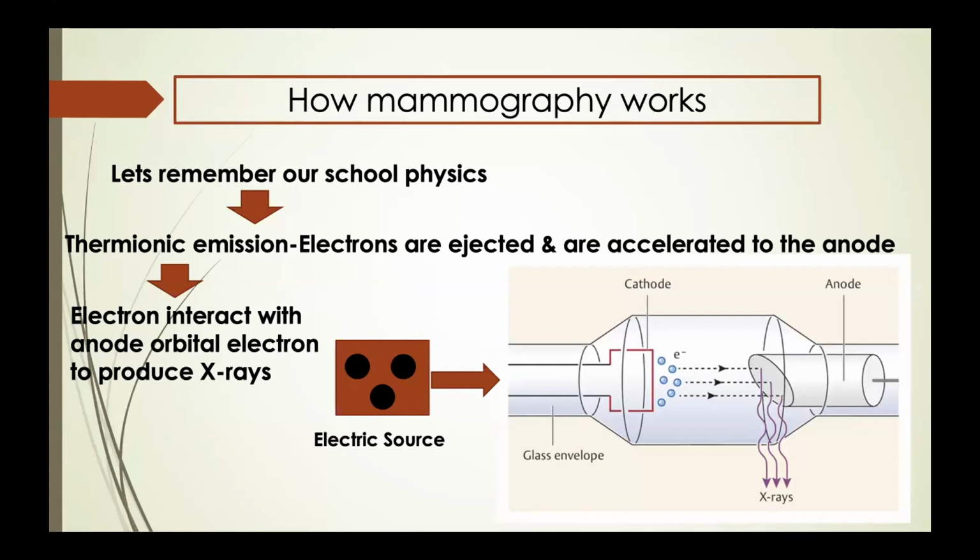We know velocity relates to energy, and speed is directly proportional to the kinetic energy. So it loses energy and we call that Bremsstrahlung. Those are just two different ways that X-rays are emitted. But the point is that fast moving electrons hit the anode and generate X-rays.